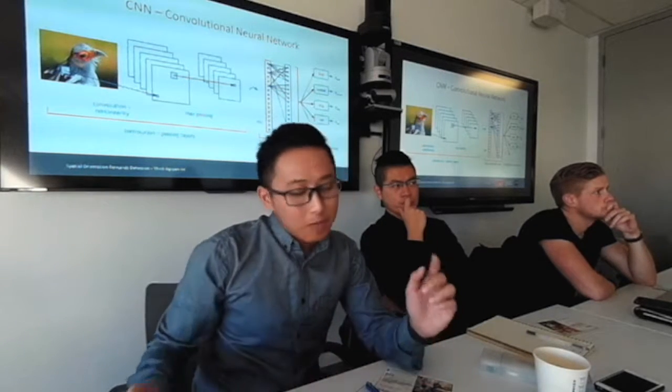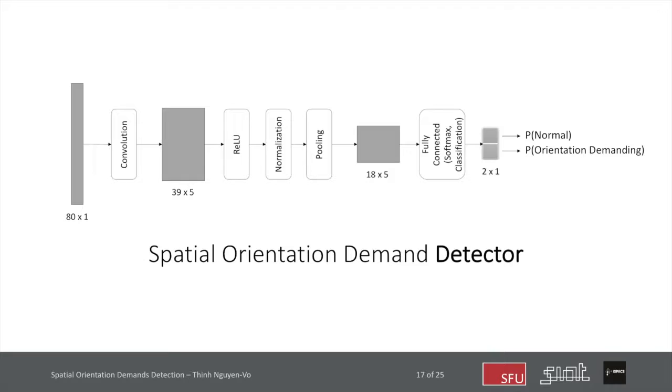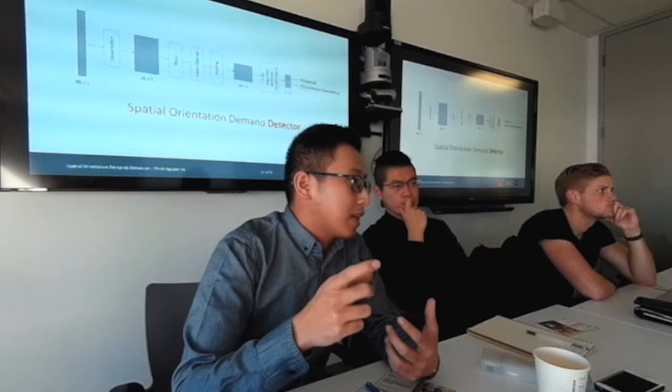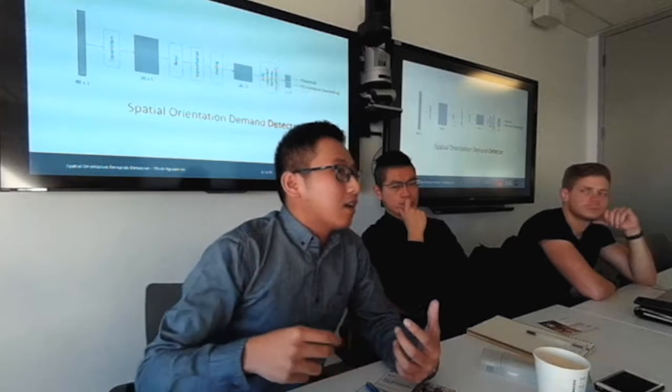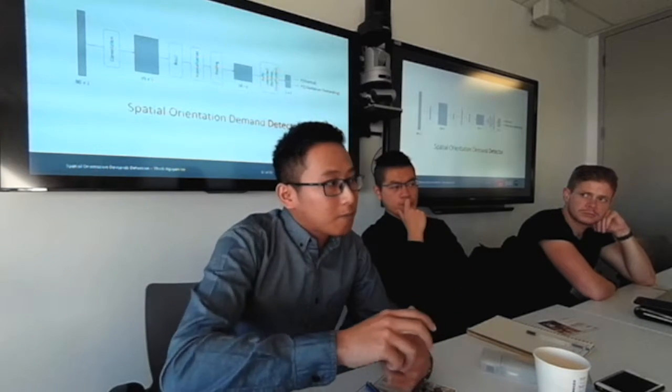Similarly, we aim to build a spatial orientation demand detector that can receive input bits of EEG data, and it will detect or predict if there is any spatial orientation demand in that data or not.